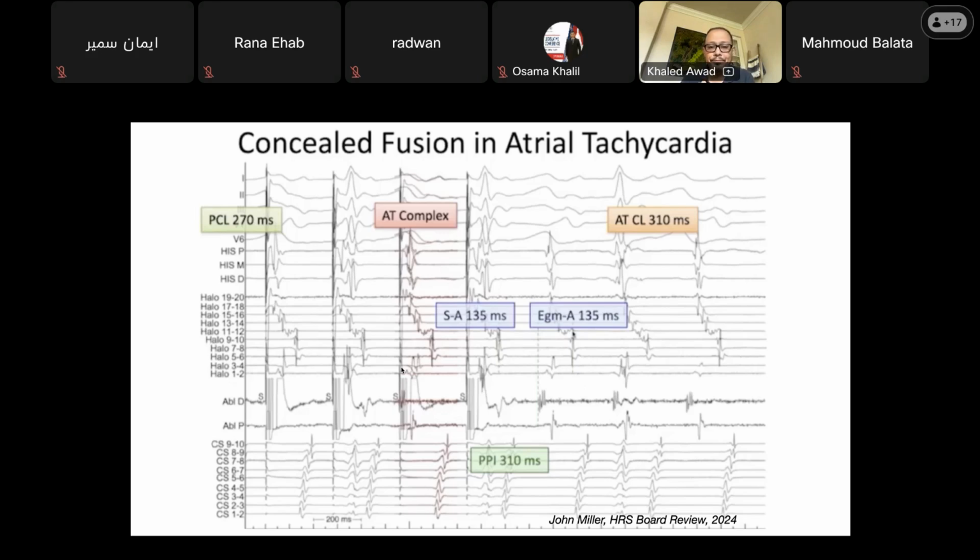He would set the extra stimulus to be delivered in that particular area, inside the P wave, and he can then move the stimulus 10 milliseconds pre, post, whatnot, usually a little bit earlier, until he can show that he's able to reset and fuse.